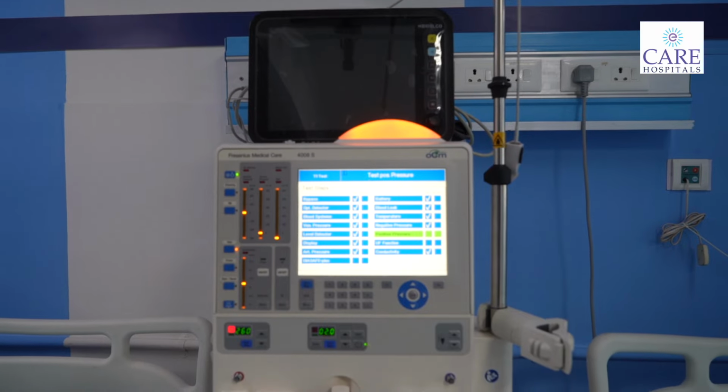Coming to the unit, we have a standard RO plant. For dialysis patients, we need to have standard water quality. For that, we have a high quality RO plant, where we maintain AAMI standards for water quality, and we continuously check the water for chemical, bacterial and endotoxin contaminants. We regularly check the water quality, and we strive to provide high quality water to our patients. Because dialysis patients are exposed to around 300 to 600 liters of water in the form of dialysis every week, we need to maintain good, high quality water standards, which we are doing in our center.